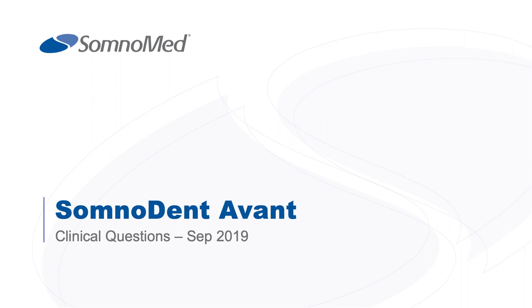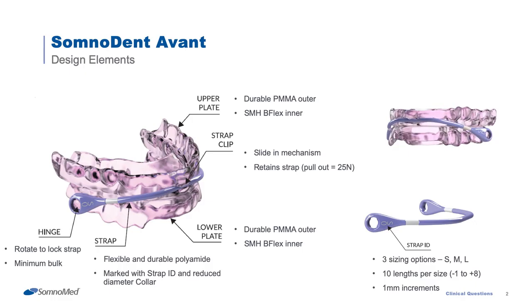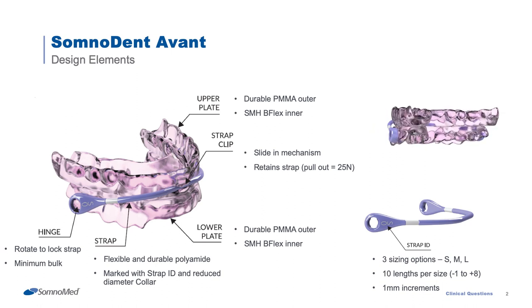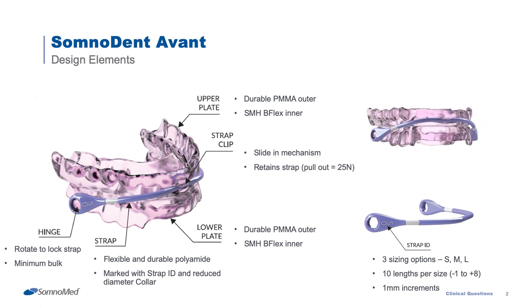This presentation addresses clinical questions on the SomnoDent Avant straps. SomnoDent Avant components include an upper plate with a strap clip at the anterior, a lower plate with two hinges located on either side. These plates are connected and held in position by the strap.